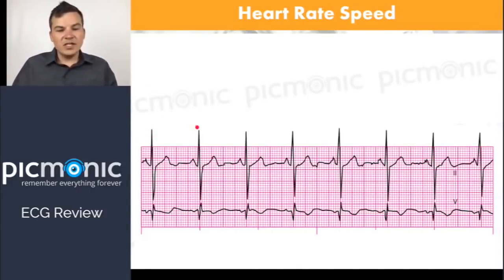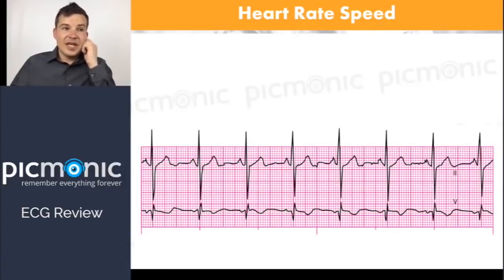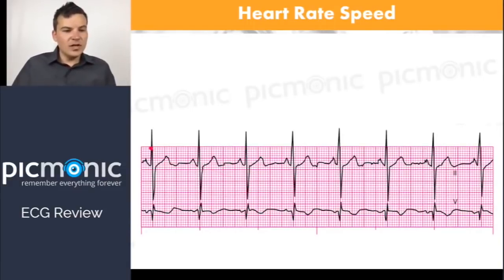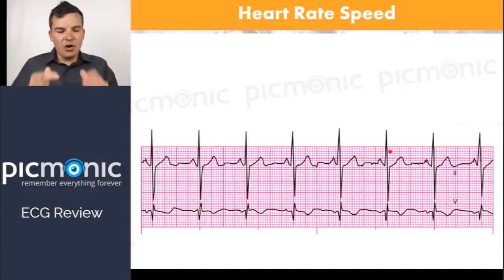Let's try an example: here's our six-second ECG, what's the heart rate? Count those QRS complexes: 1, 2, 3, 4, 5, 6, 7, 8 — there are about 8. So this heart rate is about 80. Almost every single time, you're going to be able to identify exactly what's there and tell if that's a slow rate or a fast rate.